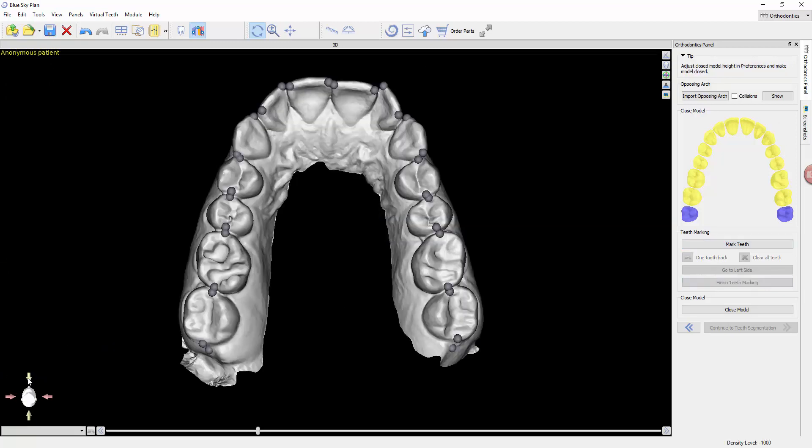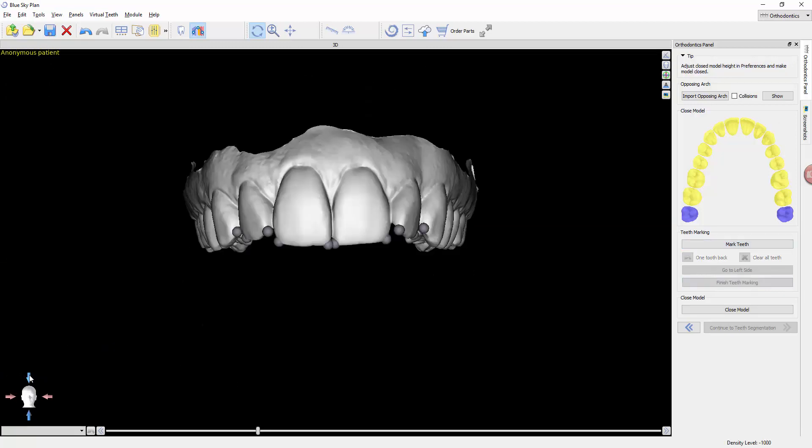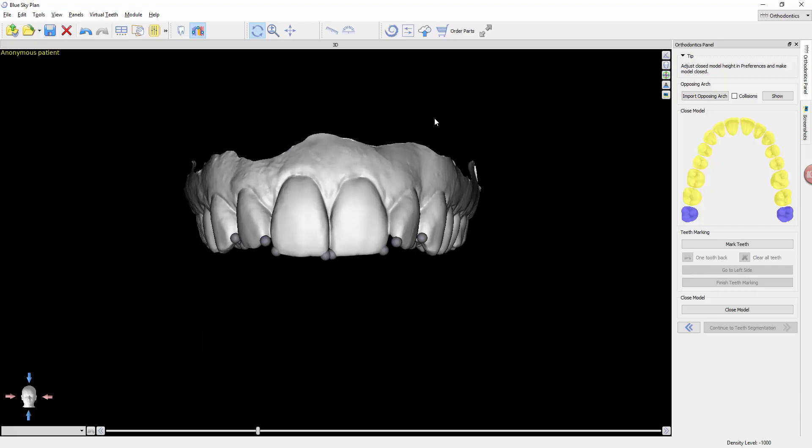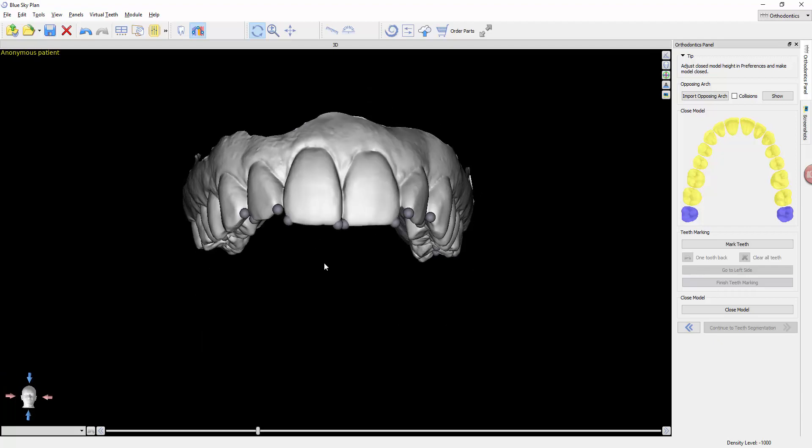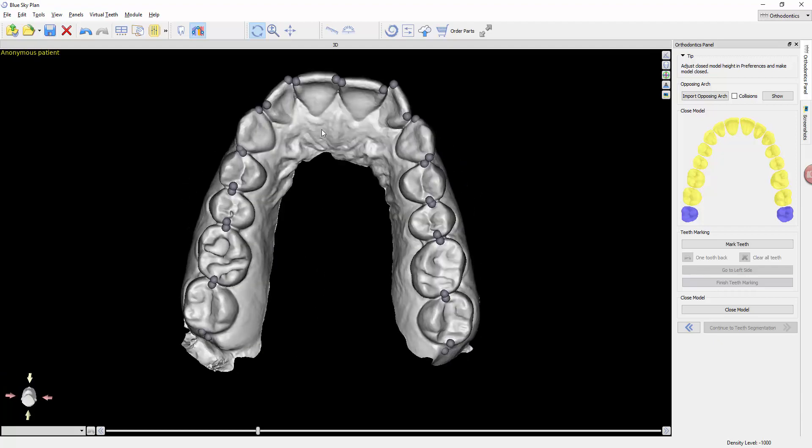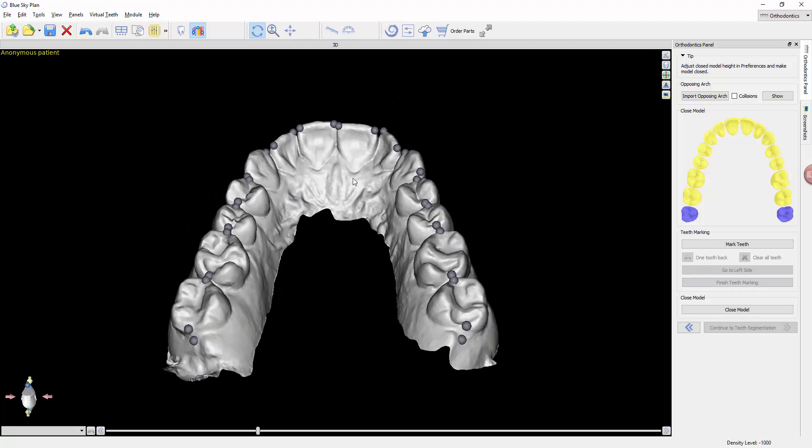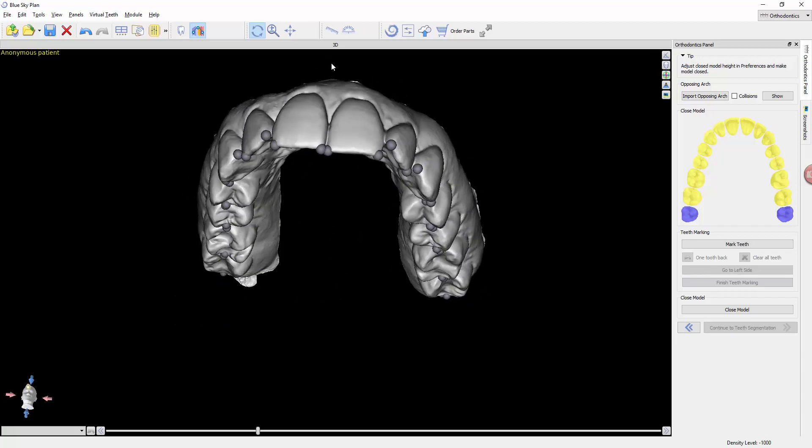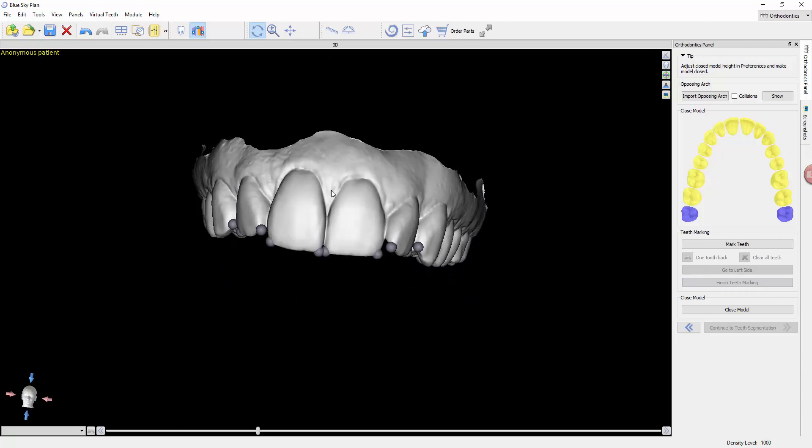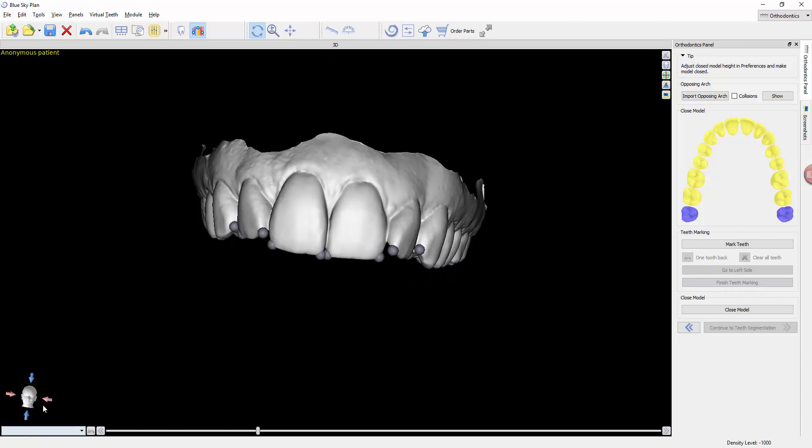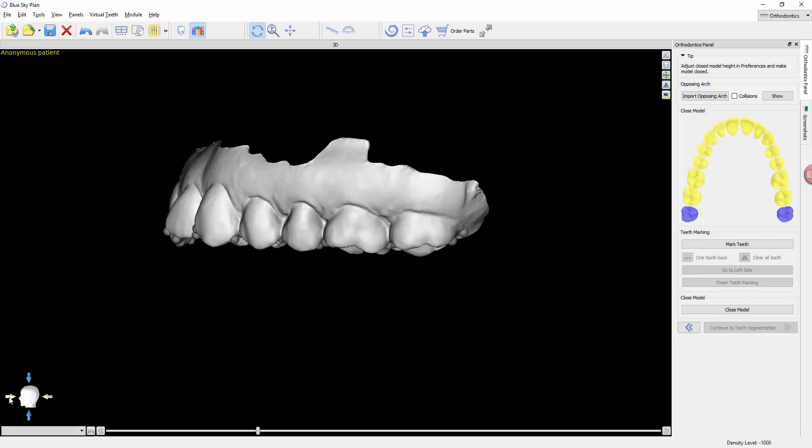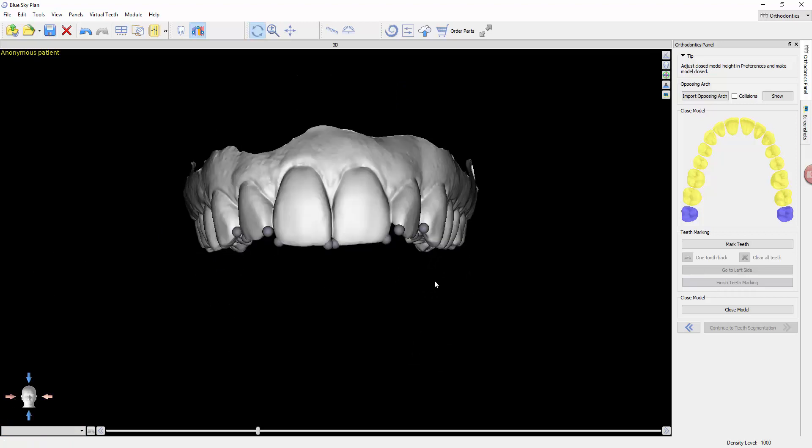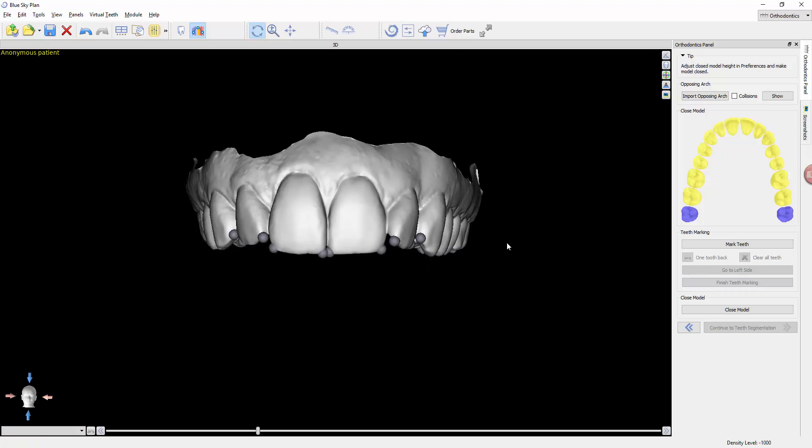Now notice that this alignment is accurate. It uses these dots to determine the orientation of the teeth, of the arch itself. It makes the curve, the plane of occlusion as flat as possible.